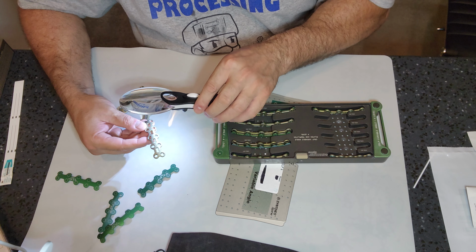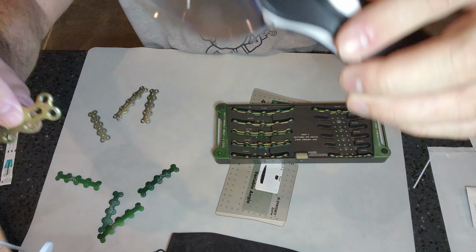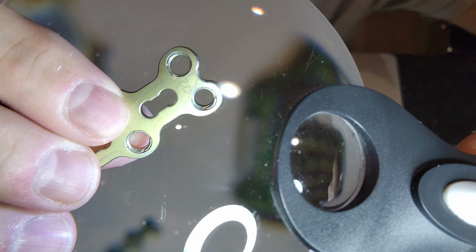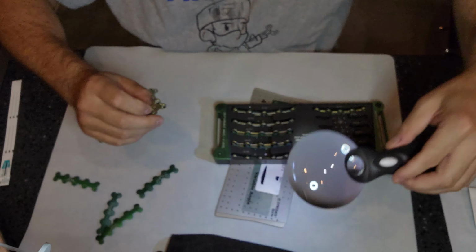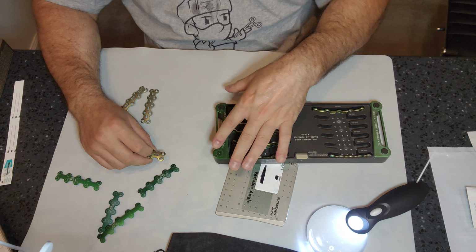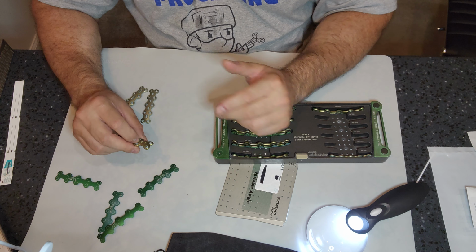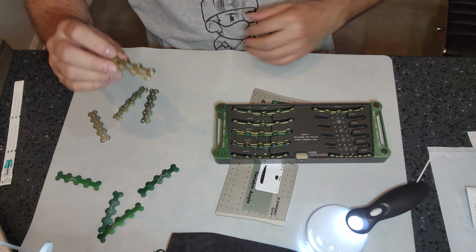Inspect for cleanliness. And look at that, guys. As I'm putting my set together, right there in the corner, a little foreign body. So what happens now? This set has to be broken down and sent back to Decon for cleanliness. But that's for another video.